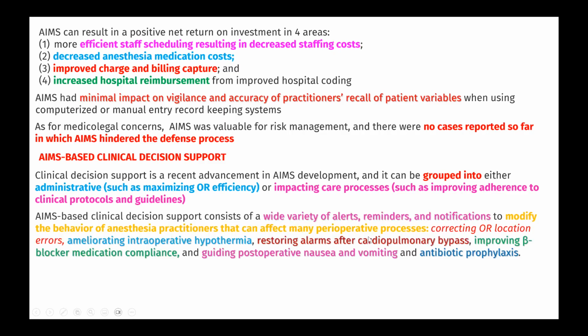They can alter their perioperative processes, correcting the errors. And you can find out what the common complications are after a particular surgery. For example, you do a Whipple's procedure in about 50 patients. You can identify all the common intraoperative and postoperative problems that you faced by going through this record. So that is how clinical decision support can be modified by using this recording system.